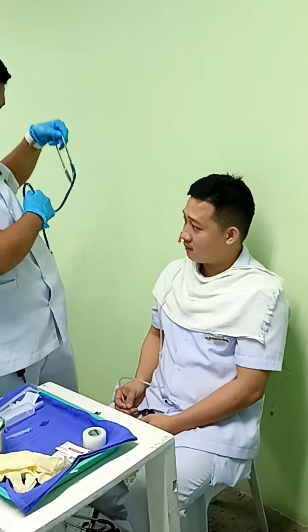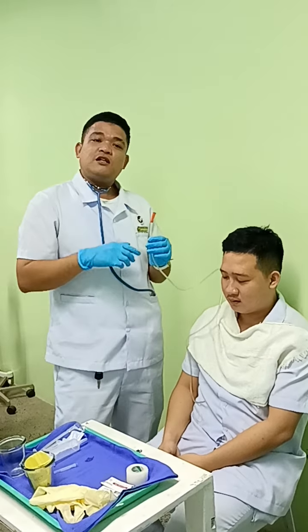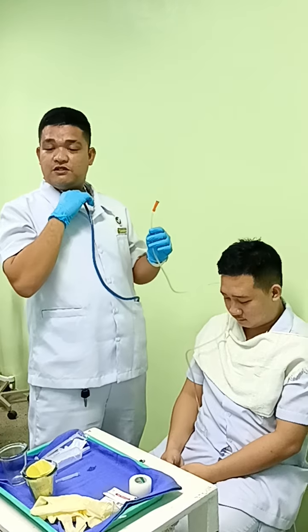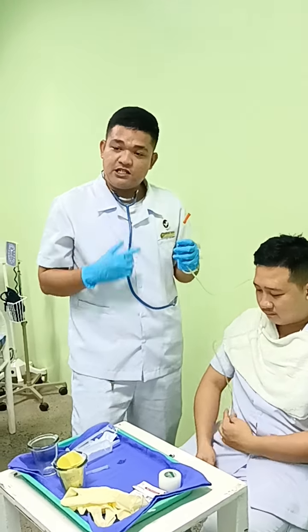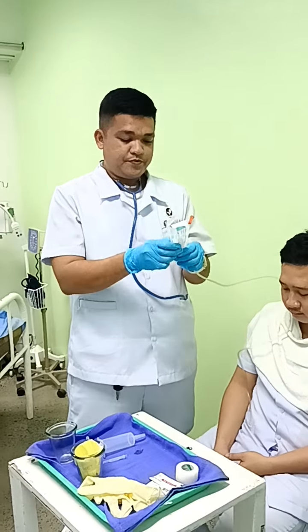After auscultating, for the next procedure, we will be checking the tube placement. There are certain ways to check the placement of the tube, but in my case, I will be using the syringe. So get the syringe.